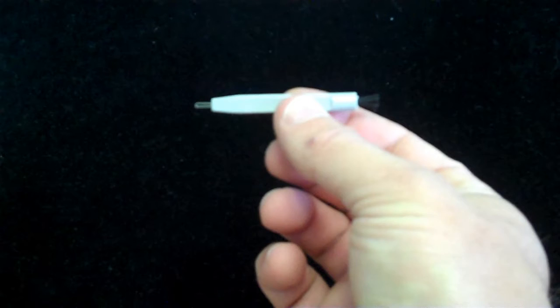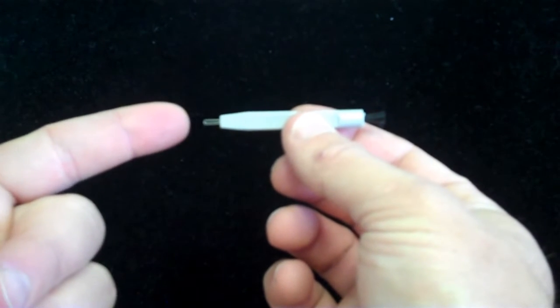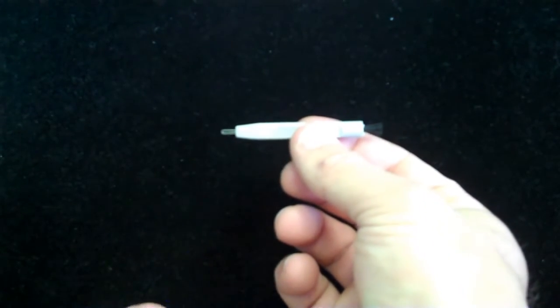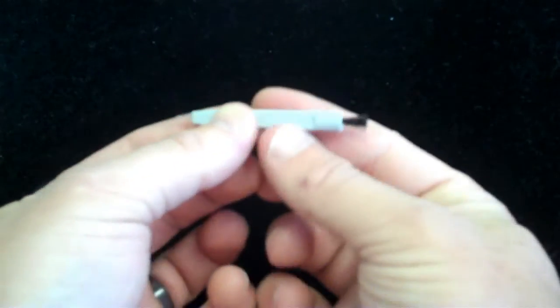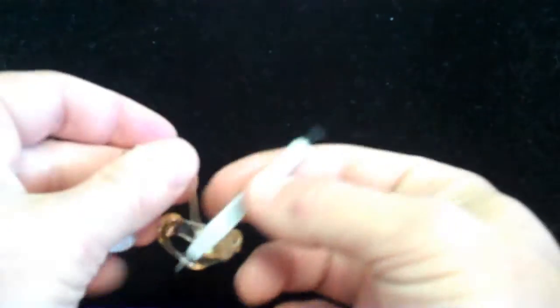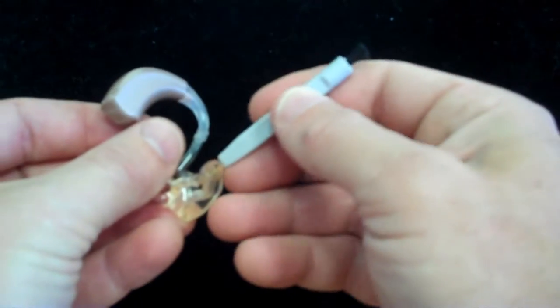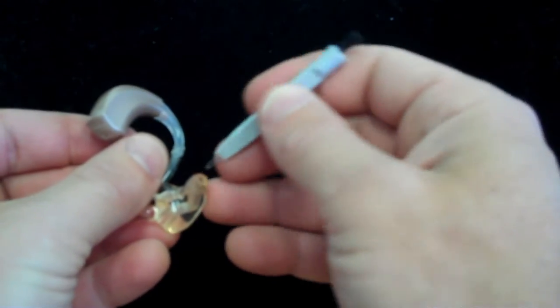The most common, or the most recommended tool to use to clean your hearing aids, is a simple tool like this, where one side has a small wire loop. Hopefully you can see that against the black backdrop there. The other side has a little brush. The most important side is the wire loop side. We're going to take that and scoop out both of these holes, thereby removing any debris.